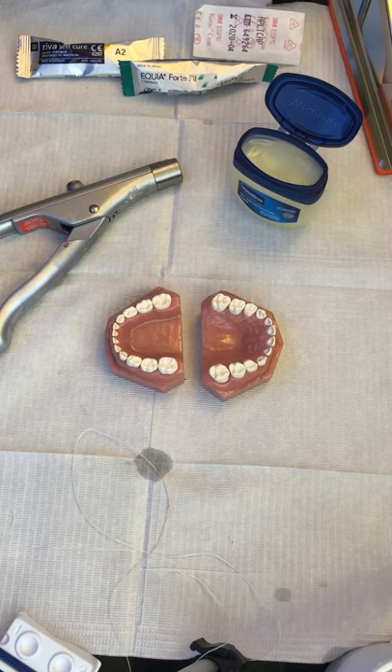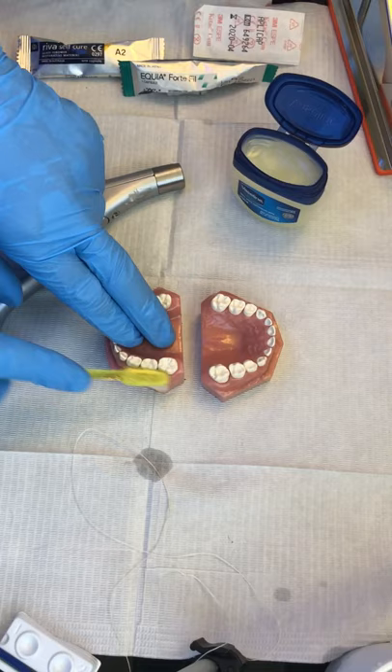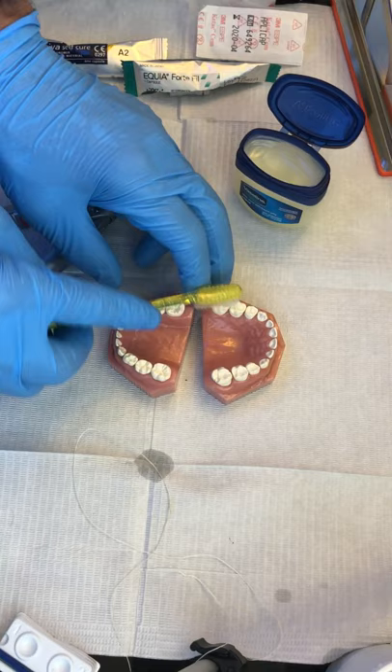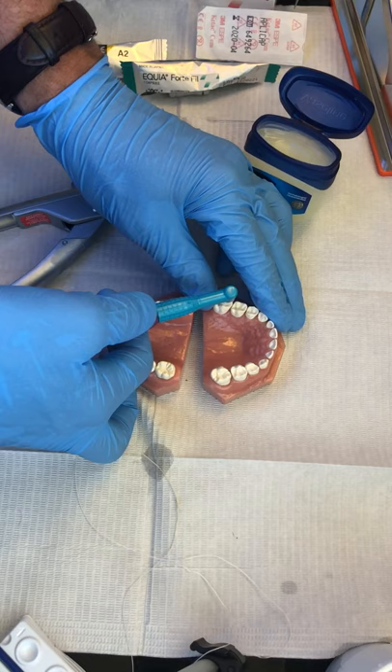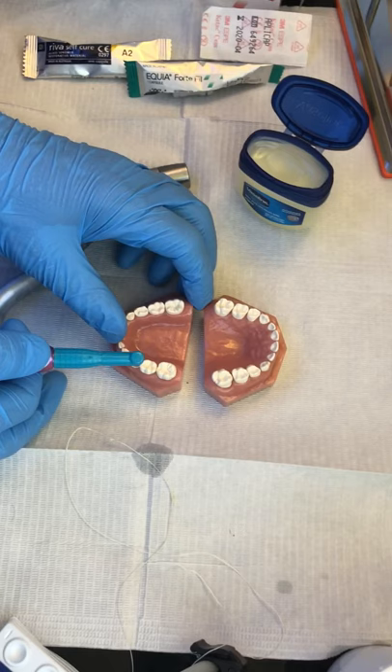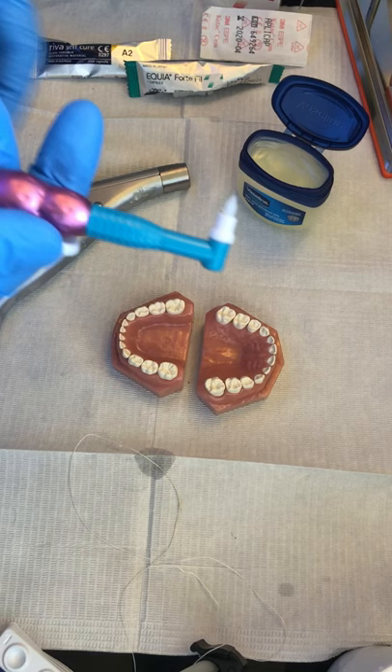We're going to prepare the teeth using a really complicated instrument called a toothbrush — usually dry so we can get a nice dryness on the teeth. Clean out debris, Cheetos, all that stuff. If you really want to get crazy, I like a contra-angle brush. You can use pumice. I don't like prophy paste because it leaves a glycerin residue. Pure pumice is probably ideal, but the brush itself does a really good job.